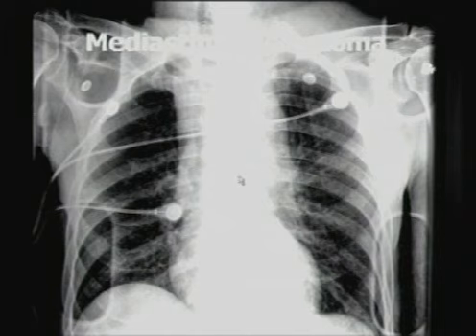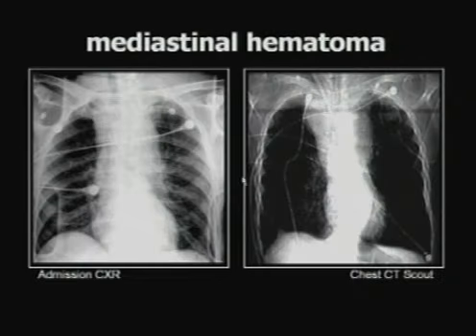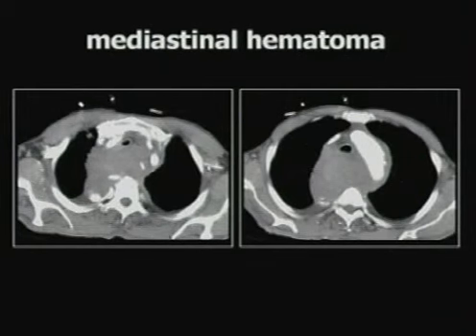But for every reason that I've shown you, and for any single one of those reasons, we obviously went to CT. When we went to CT, this was our scout view, and our right apical or extrapleural collection was now expanding in size. This got me a little bit worried. But when we scanned the patient, I saw this. There were no direct signs of aortic injury, but an awful lot of mediastinal blood. We can see we've significantly pushed the airway way forward off the spine, and we have a couple foci of very bright, dense contrast material. This was very concerning for an active hemorrhage going on in the chest.